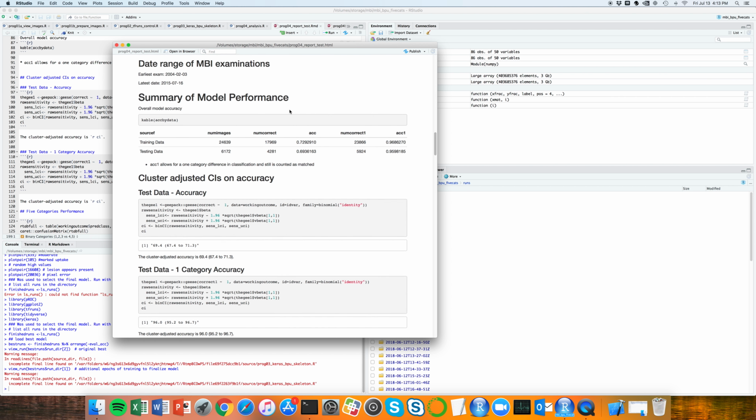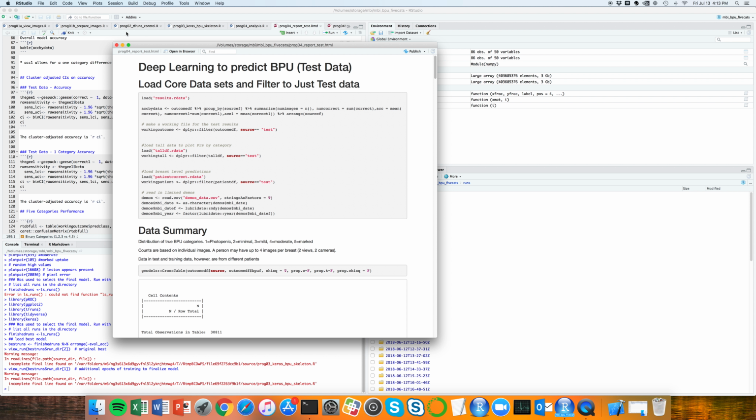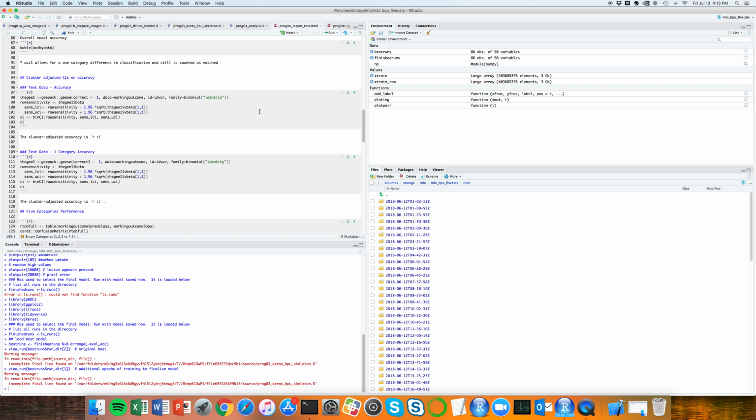And these are some of the results we have. I won't go into much detail, but that's what we have. That's the programming environment. That's how we're working towards reproducible research.